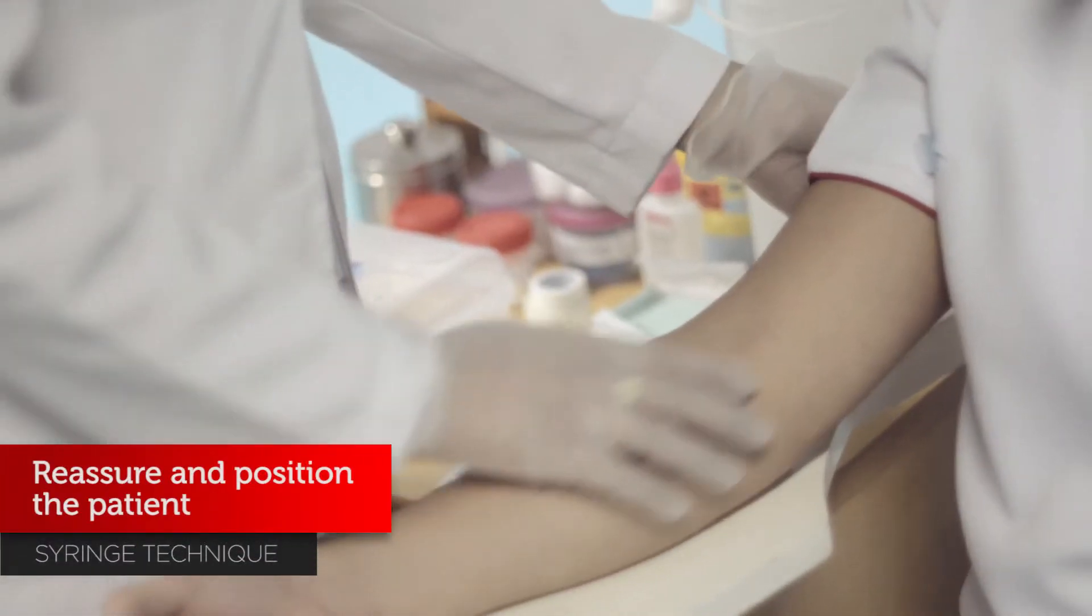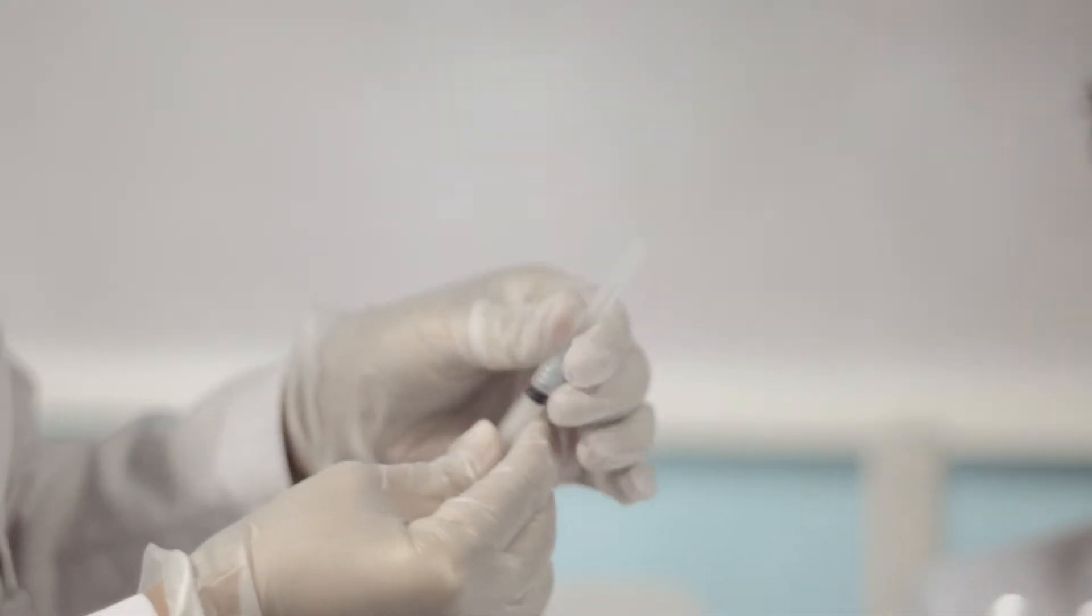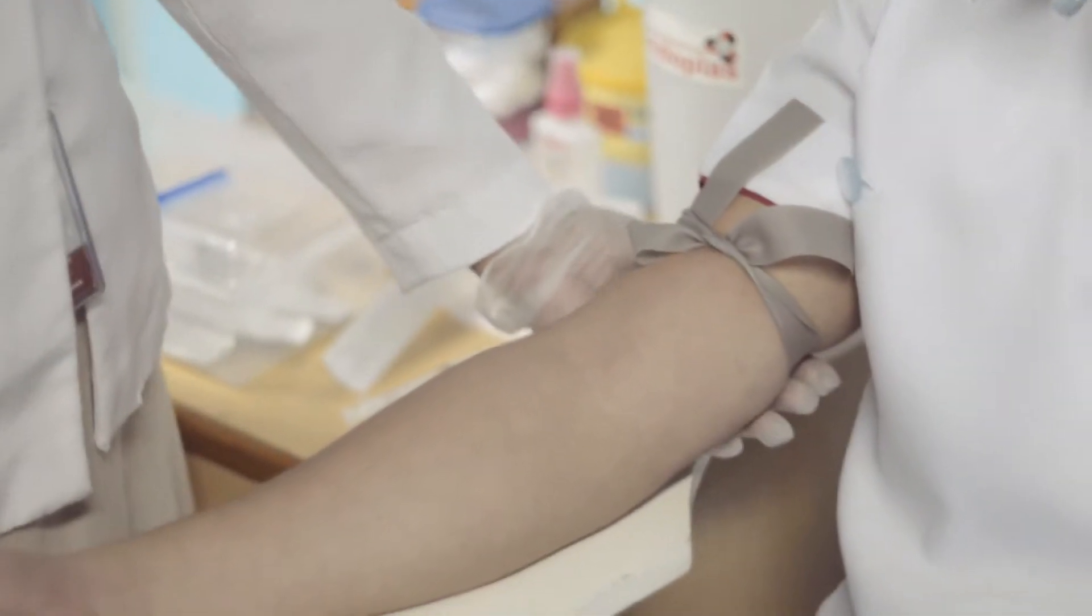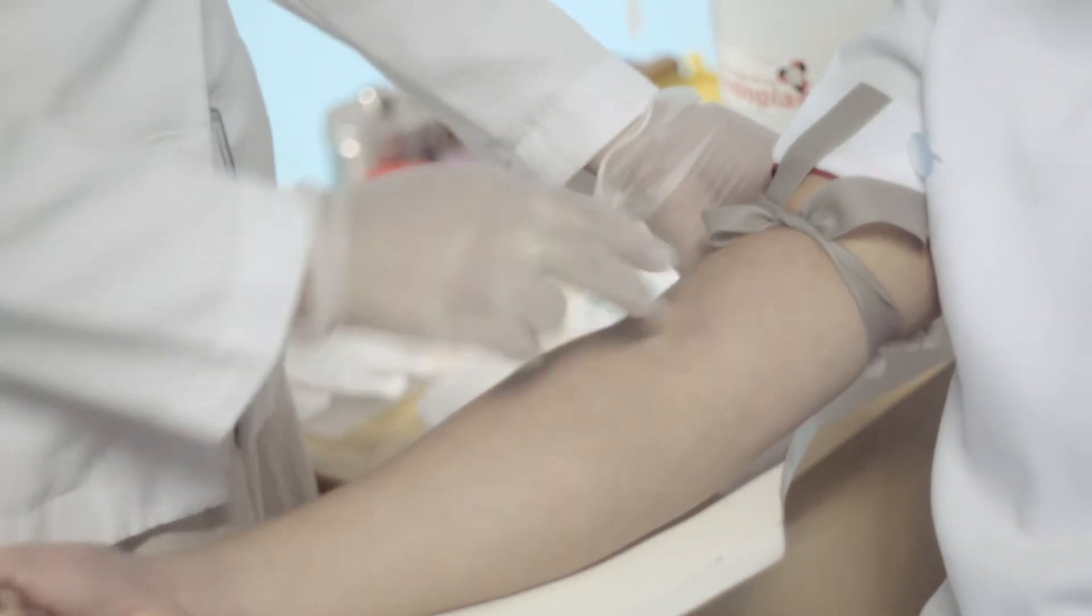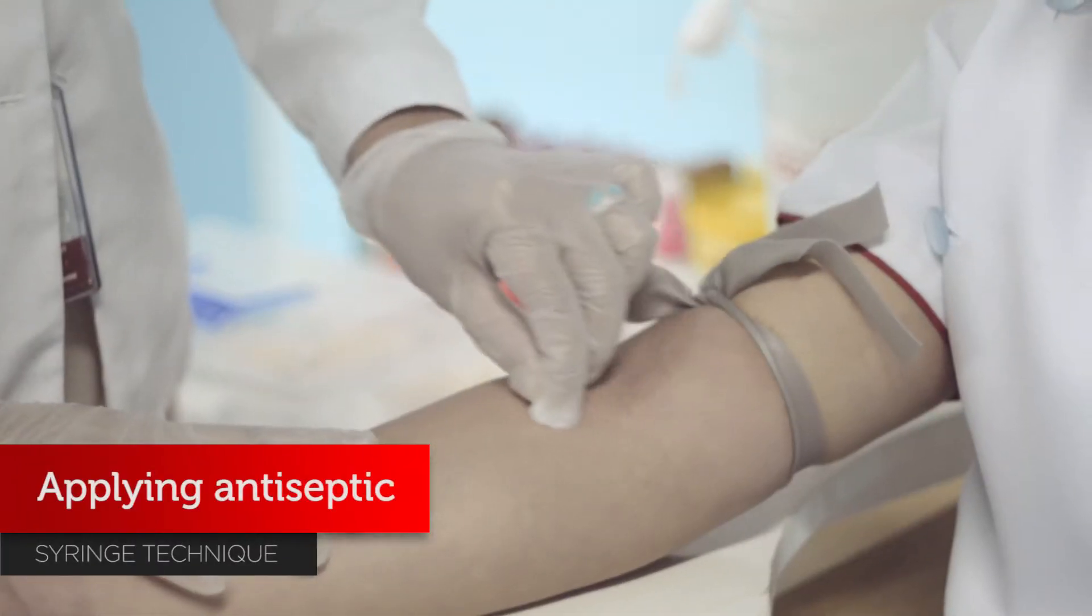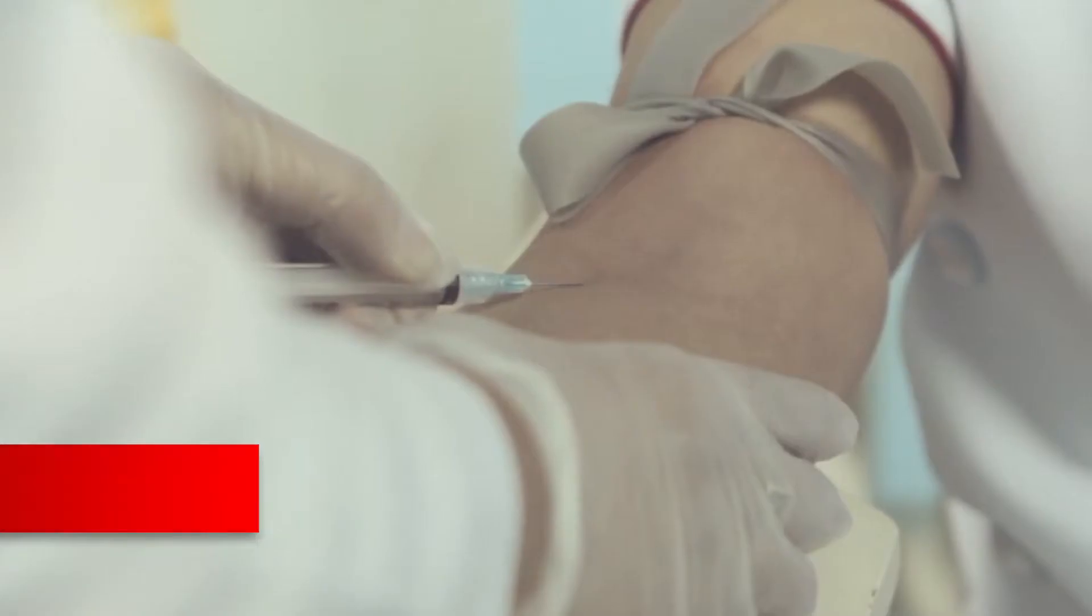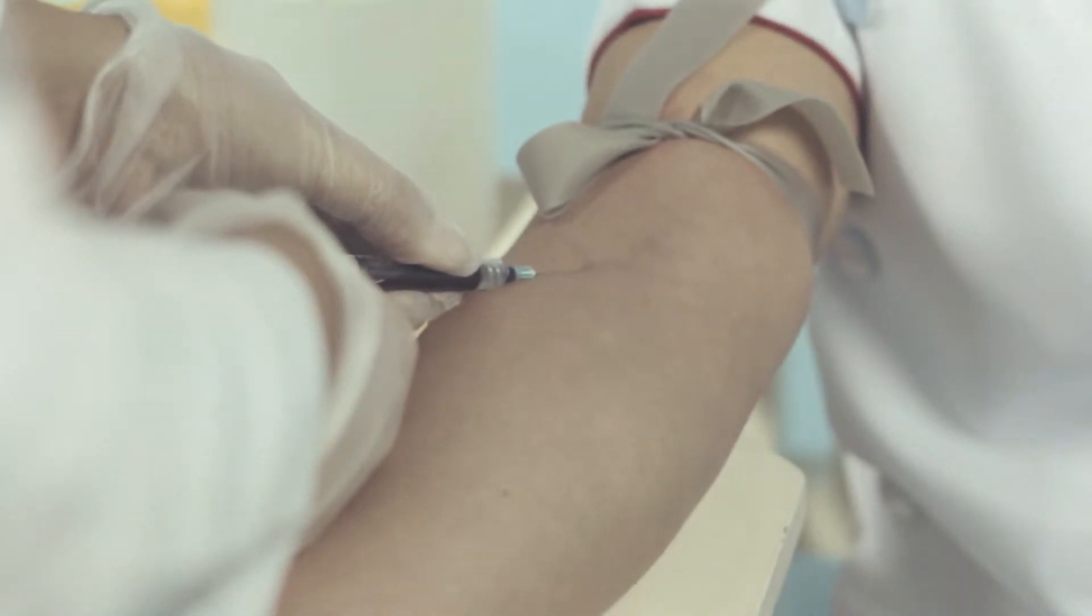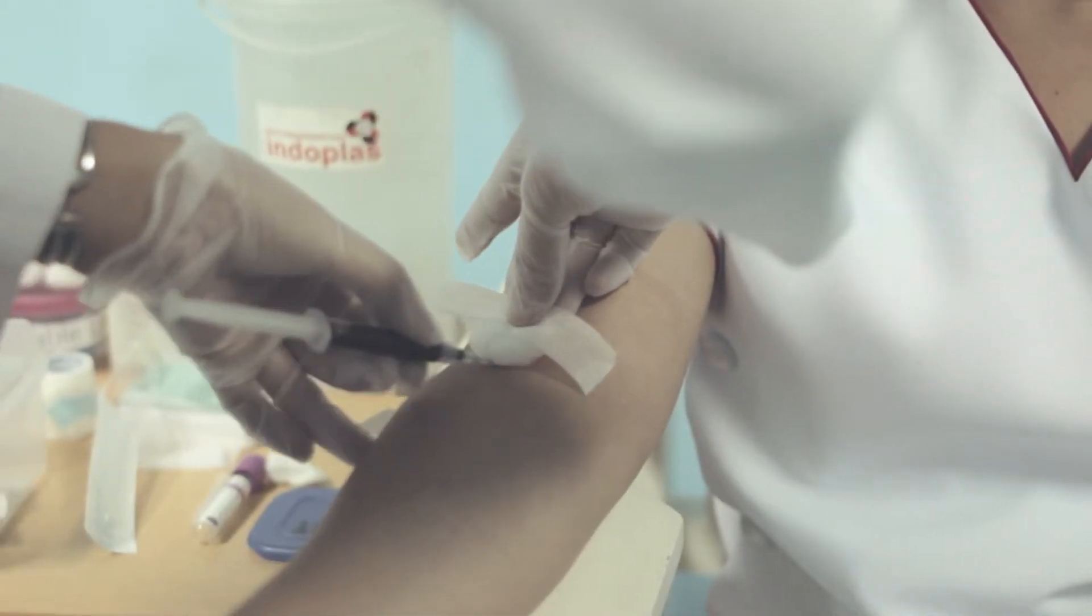Reassure and position the patient. Preparation of the needle and syringe. Applying the tourniquet. Selecting the vein. Applying antiseptic. Inserting the needle. Withdrawing the blood. Releasing the tourniquet.